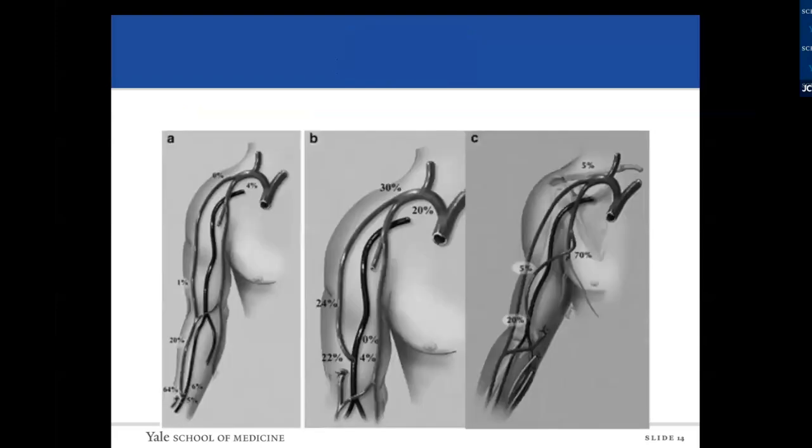All right. So where will you usually see stenosis during the fistulograms? Usually it's at the point of bend when they create those fistulas. That's where you usually see it. So it will probably be around the proximal anastomosis, or around the areas of high flow, which is the cephalic arch. We'll see a lot of fistula stenosis.